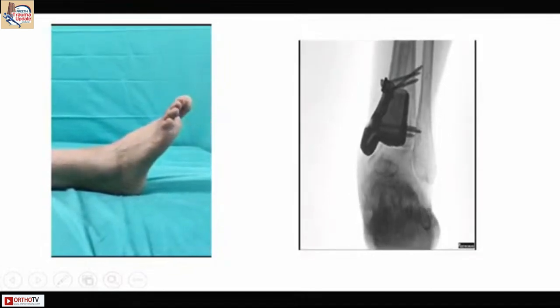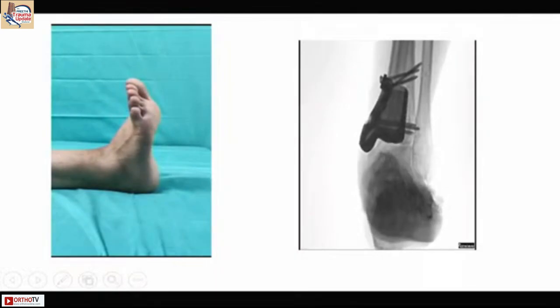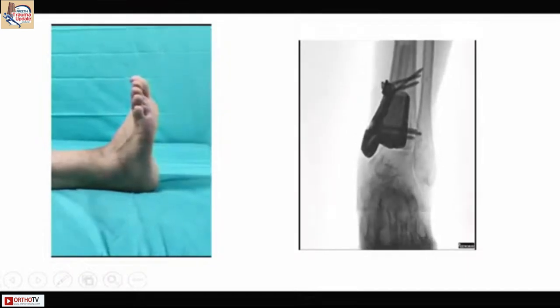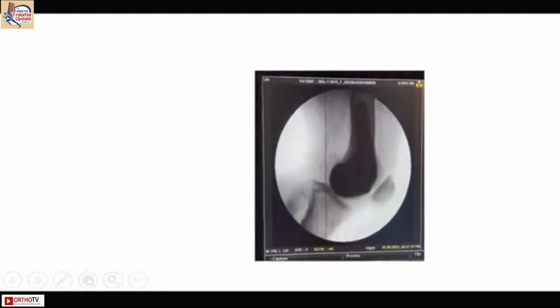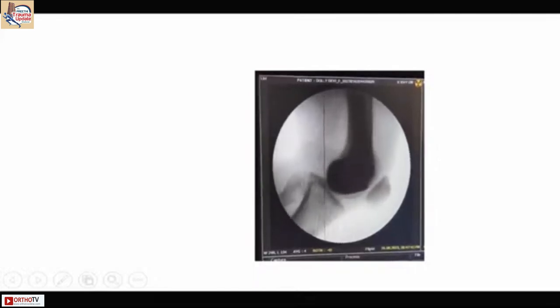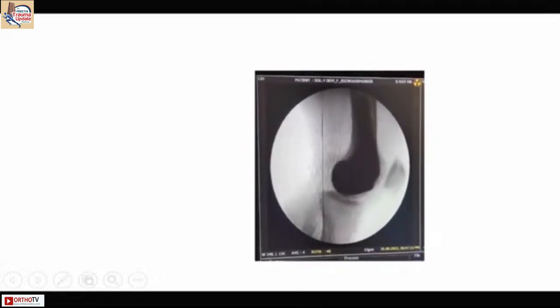This is four months of follow-up of that patient where we gave the tibial plafond, operated by Dr. Mani in Delhi. You can see it is metal on cartilage and you can see the congruency. This is the same patient where the posterior one half of the lateral condyle was replaced — it is a patient-specific implant. See the congruency of the tibial condyle over the femoral condyle, and the entire range of movement. The patient is one month post-op, painless with full range of movement.